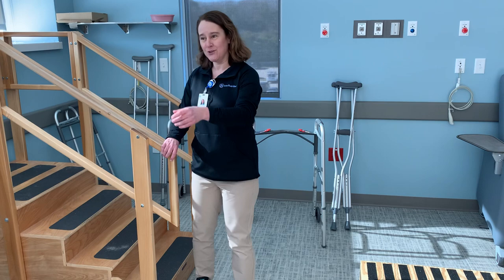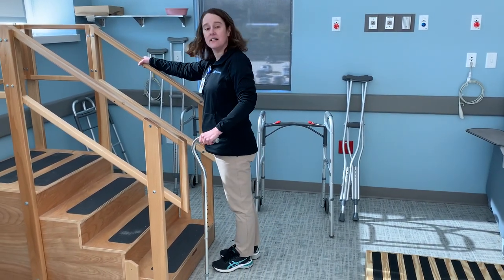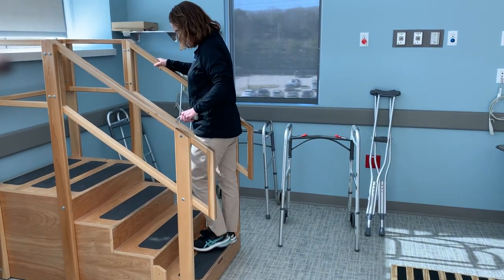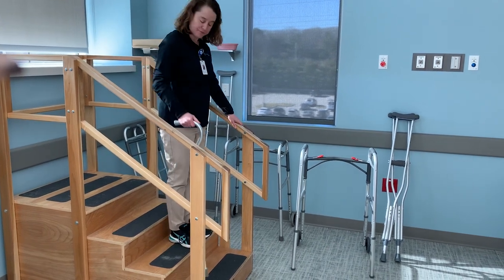If you only have one railing, we'll have you use a cane. So you'll hold the cane in one hand, railing on the other hand. Still going up with the good leg. And down with the bad leg — the cane will lead first.